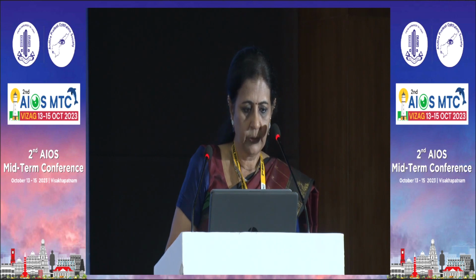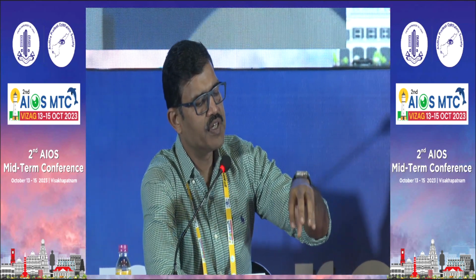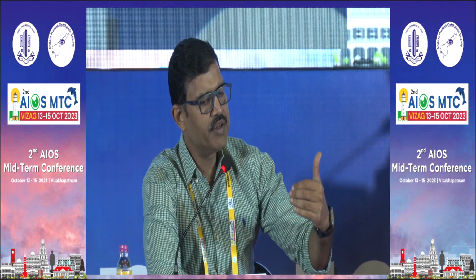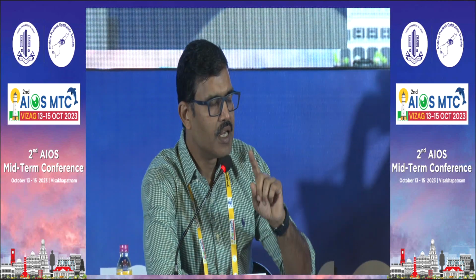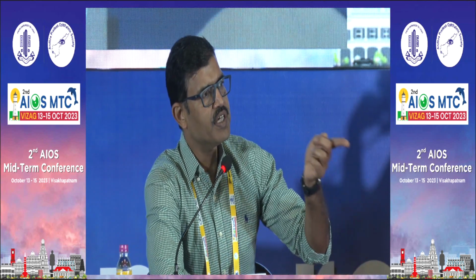Just wanted to understand from you, we all know that RLE is not something that we normally would prefer for a high myopic, but let's just keep that out of the equation. We're talking about moderate refractive errors here. Moderate hyperopia vis-a-vis a moderate myopia, and we are doing an RLE. We are choosing a trifocal. Let's talk about the power that we should choose. We know that traditionally for a cataract patient, we would choose the first plus as the residual when you're choosing a trifocal IOL. But would it change if we are doing it with an RLE for a moderate myopia vis-a-vis a moderate hyperopia?